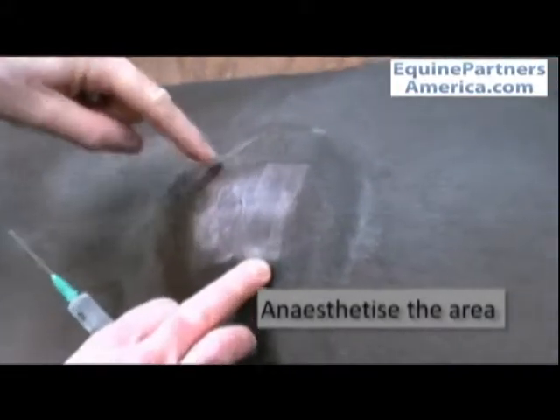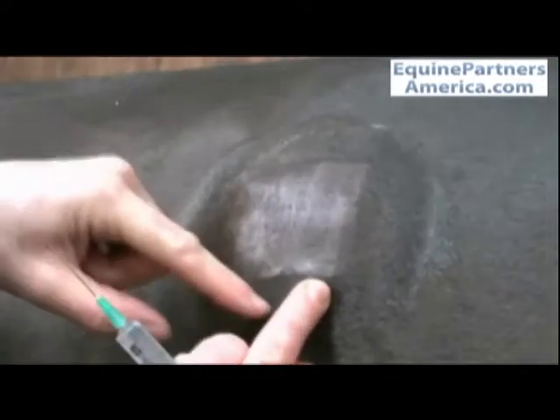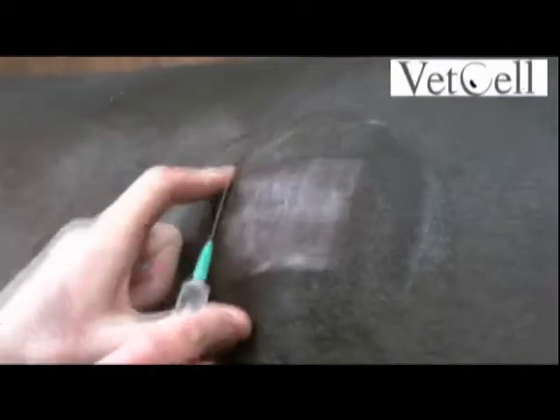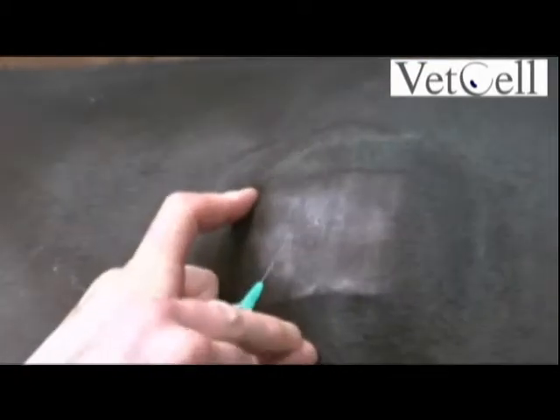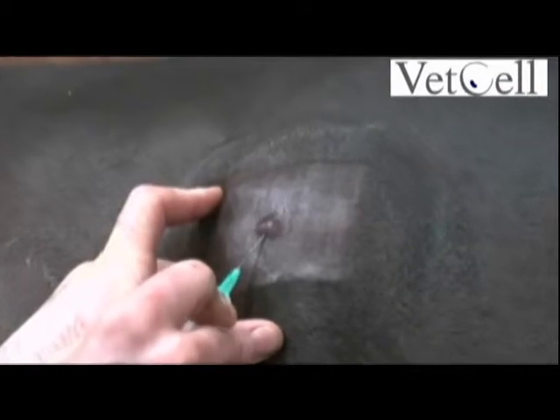Those are two main landmarks. You're going more towards the dorsal aspect and slightly caudal from it. So you can see a ridge along there. And basically we're going to step off the back of the tubercoxal.